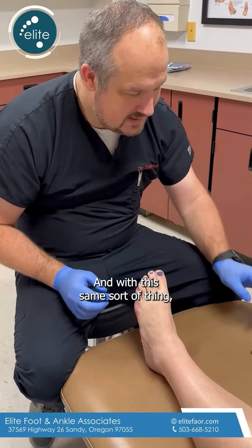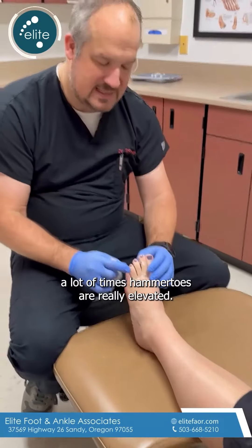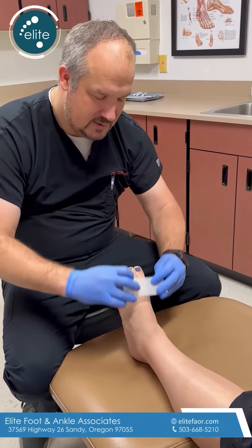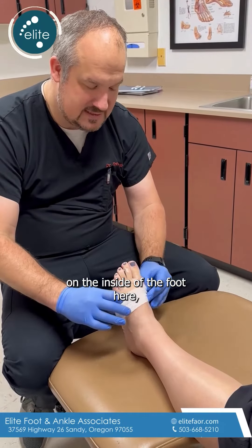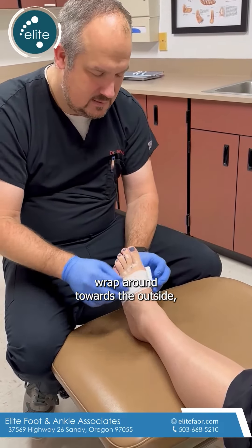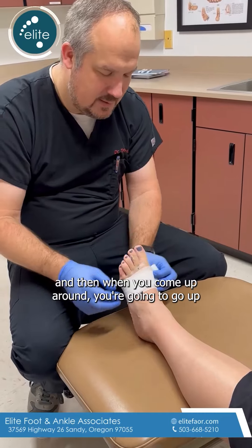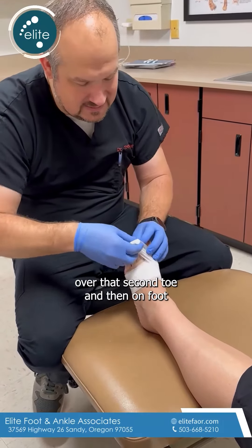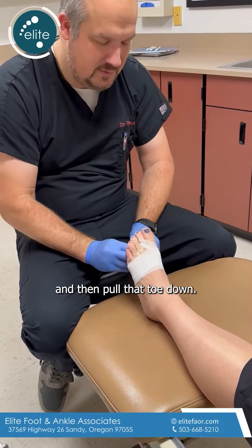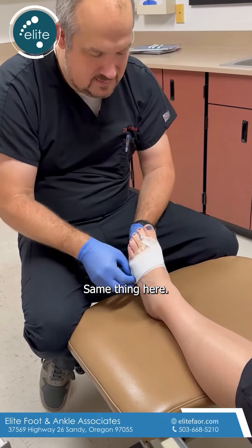With this same sort of thing, a lot of times hammer toes are really elevated, so we want to make sure we keep that toe down. We're going to start on the inside of the foot here, wrap around towards the outside, go around a few times, and then when you come up around you're going to go up over that second toe and then pull that toe down.